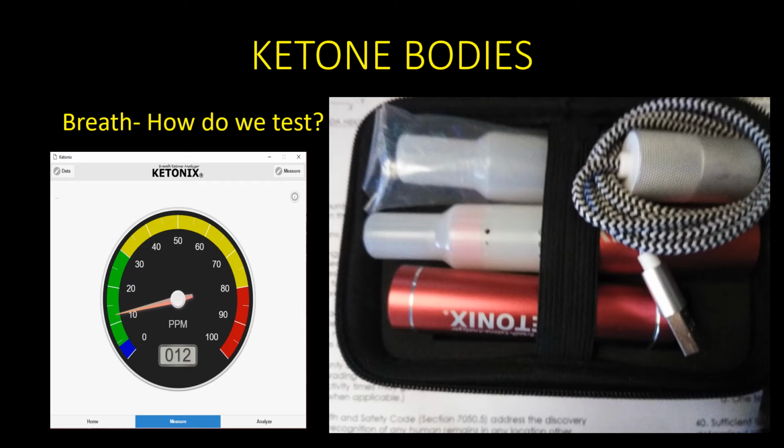This here is the Ketonix unit. As you can see, it has a USB cable, and you plug it into your PC or your Apple computer, and then it has a screen like this over here, and it's measuring acetone in your breath.